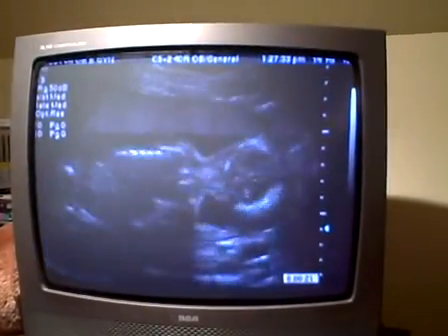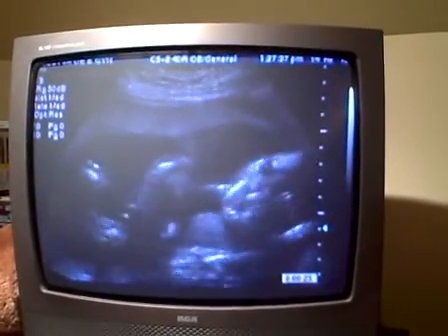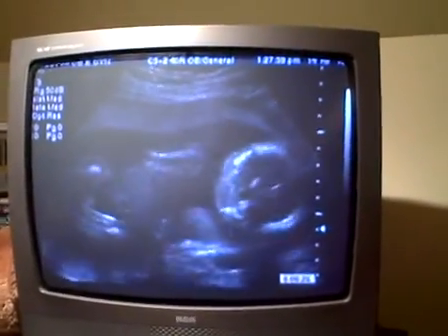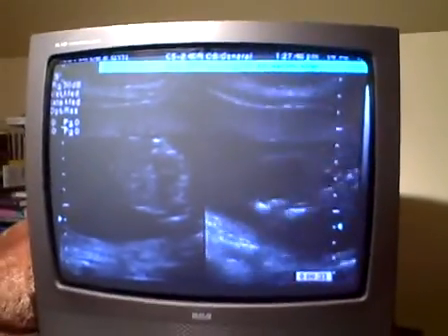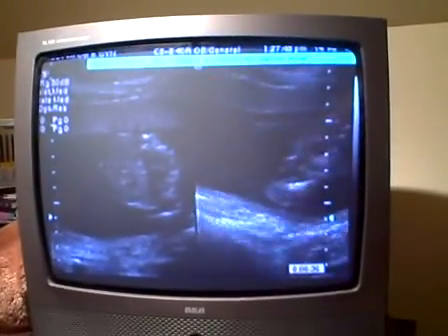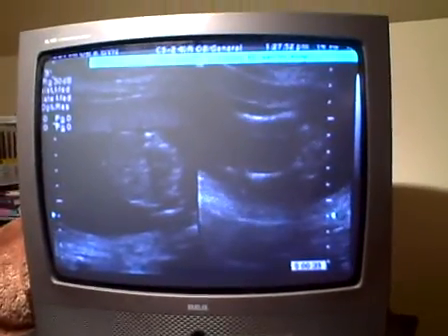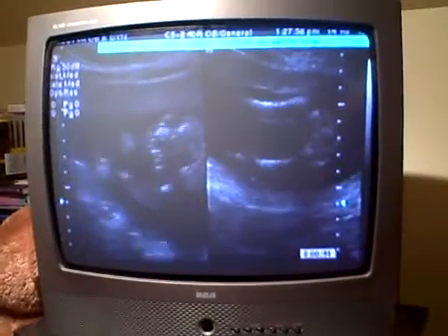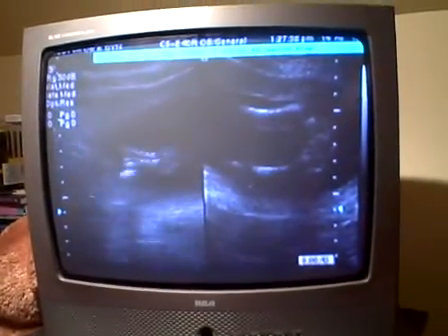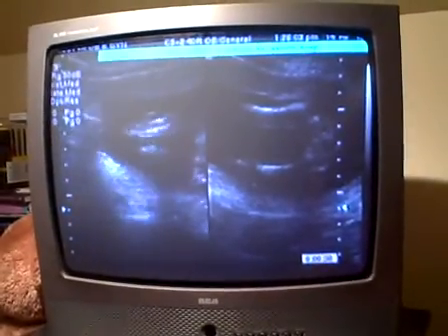A lot of this is going to be sort of slow, but that's the baby moving, touching his face with his hands. I think that's a forward view. Some of this is hard when you don't have the tech telling you what's going on, but I'm doing the best I can. Sometimes she'll freeze it and then she'll type what it is that she's looking at.